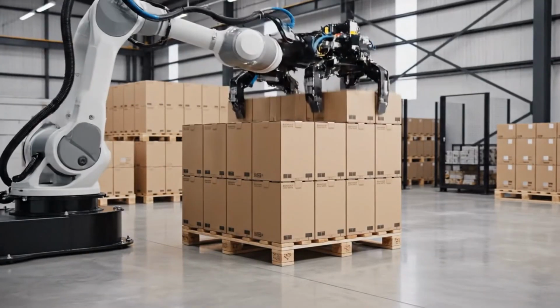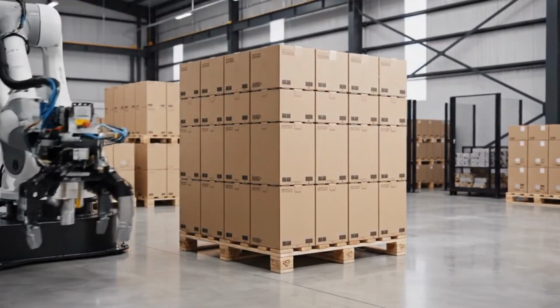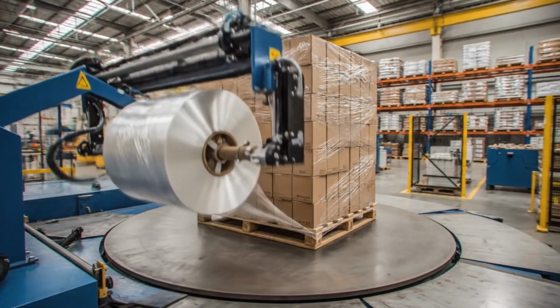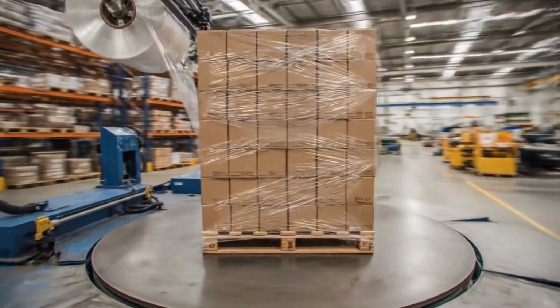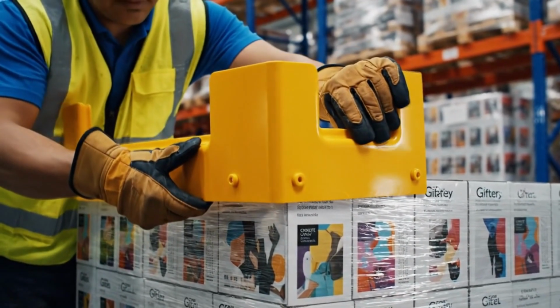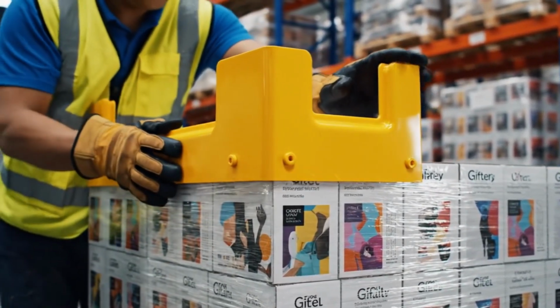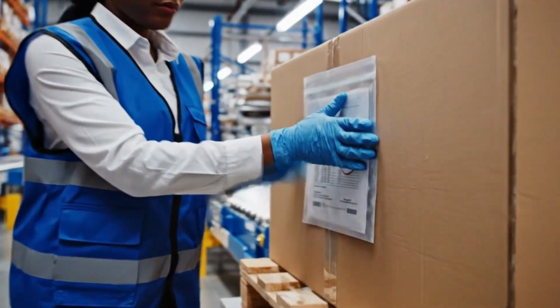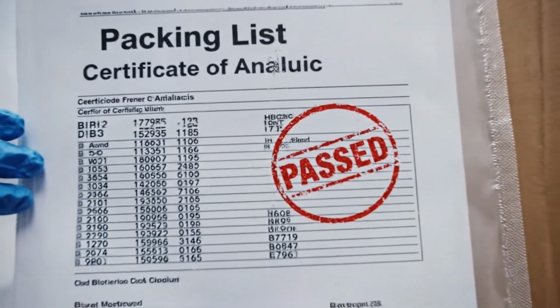Geometry is the key to logistics. An interlocking stack ensures the pallet won't tip over on a rocking ship. We apply hundreds of pounds of tension. The plastic becomes like a second skin, protecting against dust, rain, and theft. Even the edges are protected. We ensure the retail boxes arrive in gift-quality condition. Every pallet has a birth certificate, a document that proves it survived every test in Phase 7.